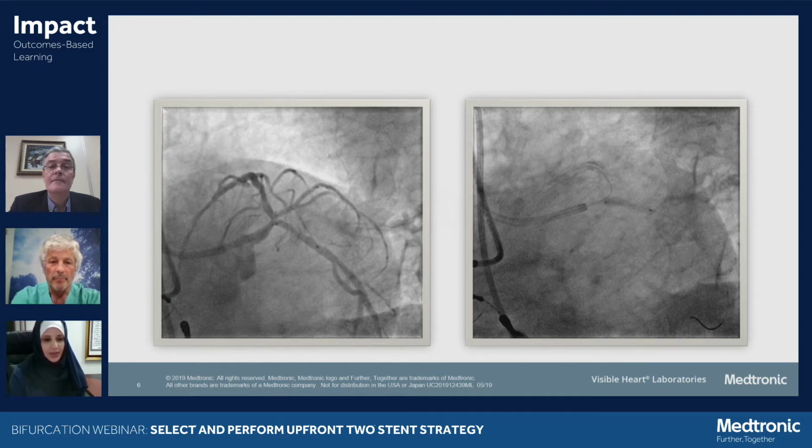But in addition to that, one thing I have learned, even from this particular case, is that intracoronary imaging really does help guide you and sometimes change your strategy. When I went in thinking this is an 80-year-old plus man, we actually had our rotablator on standby, and we decided to do imaging first. We didn't need the rotablator. The imaging clearly showed us that despite being over 80, he did not have enough calcification to justify rotablator up front. And so that was a change in strategy based on imaging.